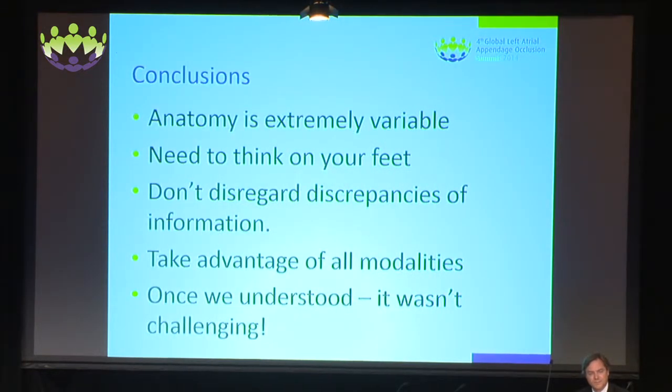So my conclusions on this case are really, as we know that the anatomy is extremely variable, you need to think on your feet. Don't disregard discrepancies of information. If the two modalities are not matching, something's wrong. You're doing something wrong. Stop and rethink. Take advantage of all the different modalities that you have at your disposal. And once we understood, it really wasn't very challenging.